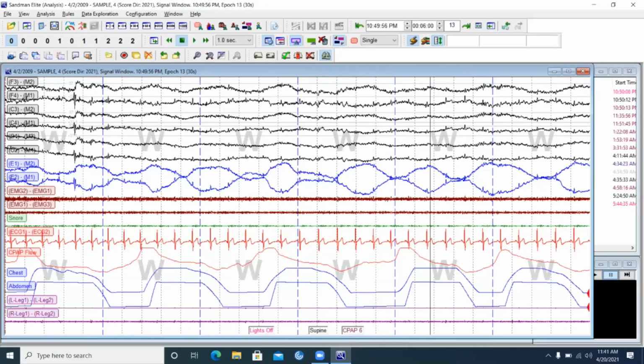This is Sandman. I can't do them on this computer because it's not a collection computer, but I'll show you how to get to them. One of the options up here is calibration. That's where you can get to all your calibrations on the Sandman computer. You can get to your AC amplifier cal, your biocals, your impedance test. I don't have it here because it's only analysis on this computer where it says calibration.